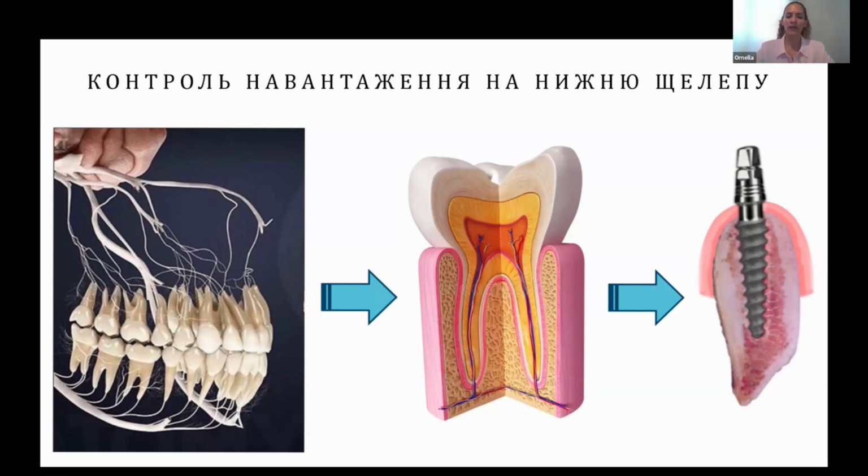So when we need to substitute a tooth with an implant, as we can see in the image, the implant is completely screwed into the bone. Now we don't have any nervus, and now we don't have any periodontal ligament. So the one that is going to suffer continually the forces that we produce daily when we are biting is going to be the implant.